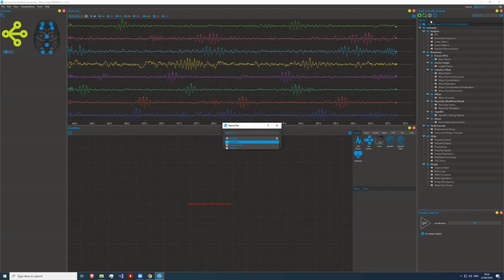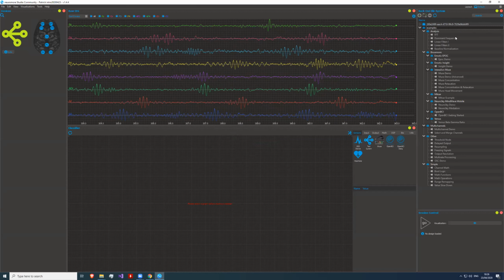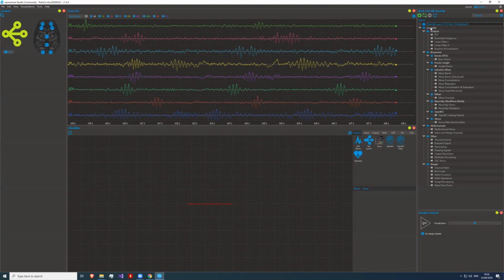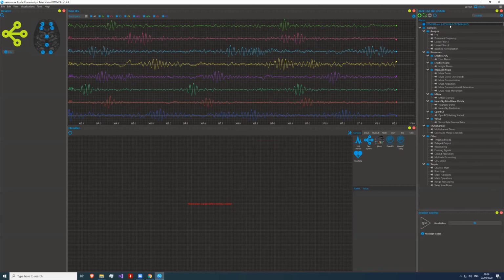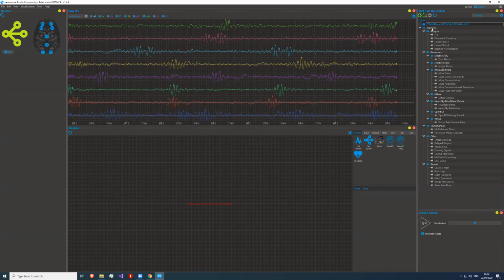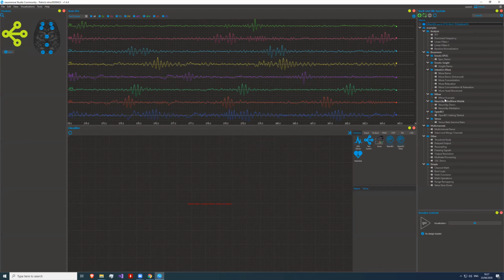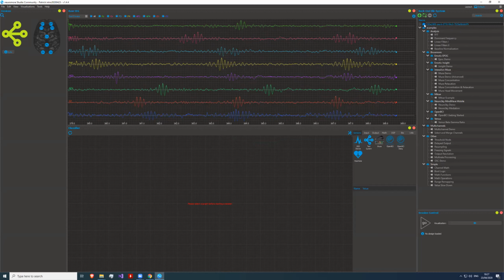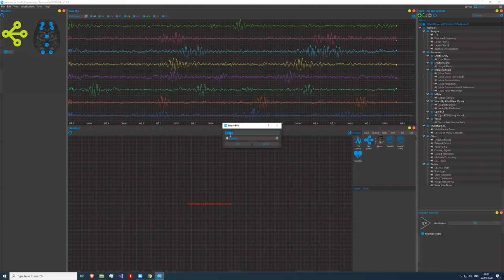So in that backend file system on the side, you see there's that folder with that long number. That's my long UUID for that account that I created just for today's meeting. So that's your personal space. Whatever you create in here just belongs to you and is yours. And down here, you see that we also have some examples that are ready to be looked at. You cannot create any files down here in those examples. So if you want to create a new classifier, you just do that in your user folder.